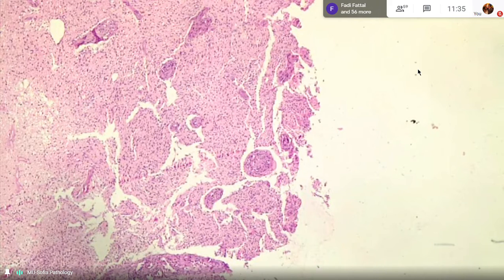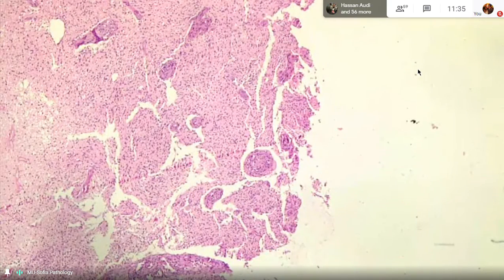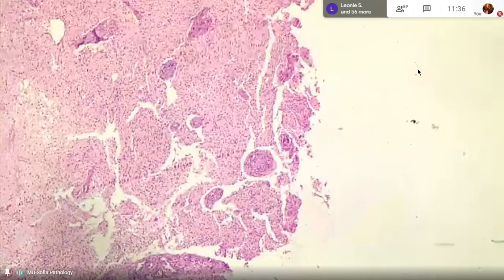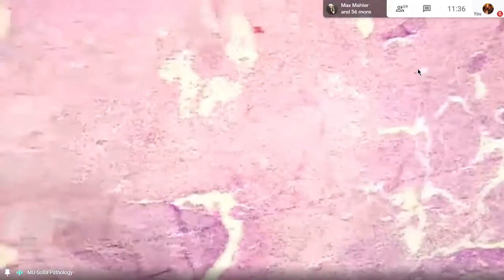So recognizing that this is a malignant tumor, you have a very large area of differential diagnosis. You can suspect sarcoma. This is what you should have in mind, because if you don't have normal brain tissue around, you have no idea where this tumor is taken from. That's why you have a problem on the exam. So the glomerular structures with this proliferation of the vessels, the necrotic areas with the palisading of the nuclei, and the severe pleomorphism of the cells.